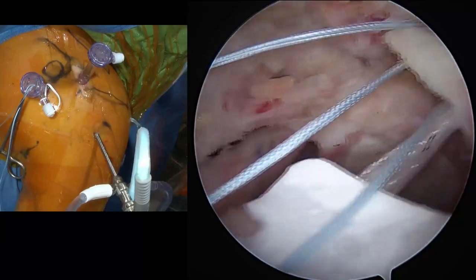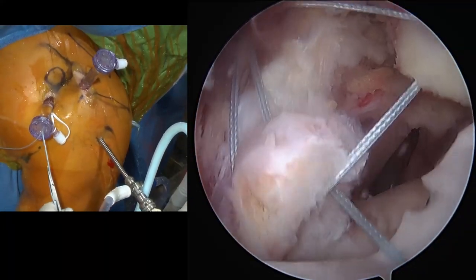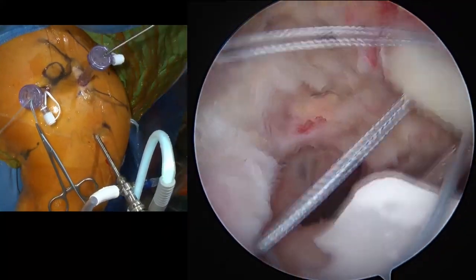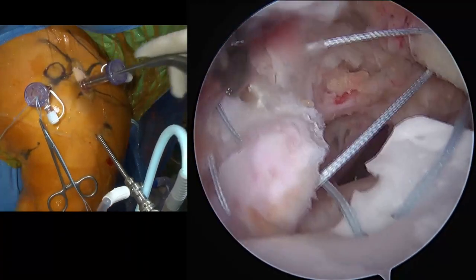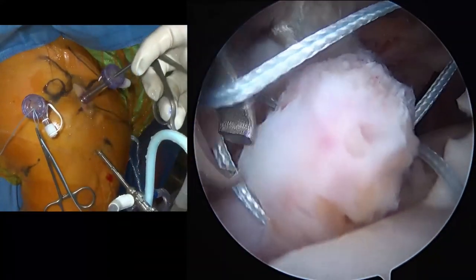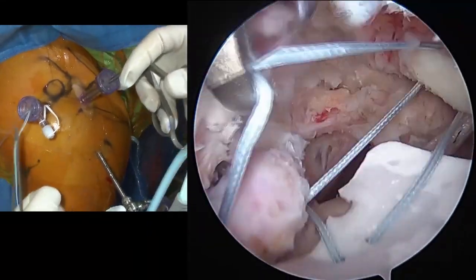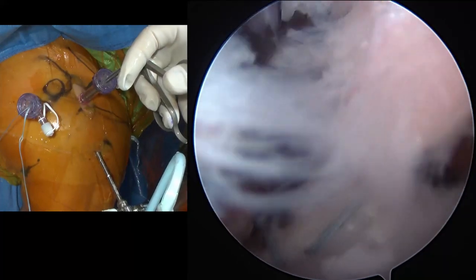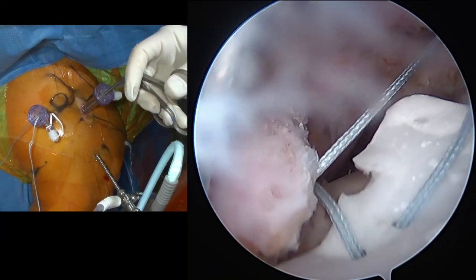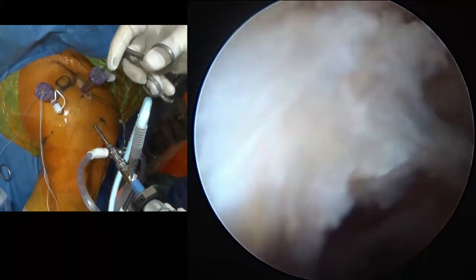So what I want to do now is repair this one back to this one so we can get those holding together. And I think we just have to pull those out of the same cannula. So let's go back down here and tie that. So that'll be this one and this one. Okay, take the hemostat off, please. Hold the scope. You're going to have to get off the Mayo stand because I've got to raise it up. Okay, that'll give me a little less distance.